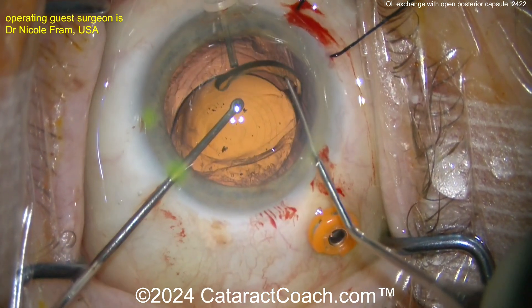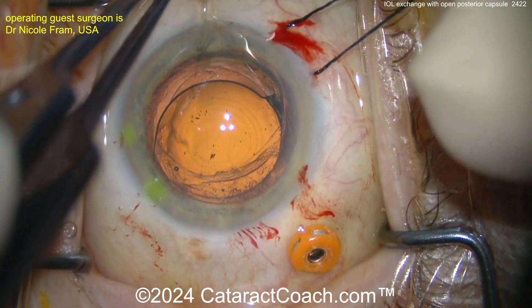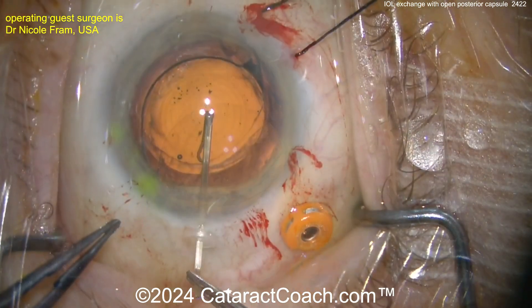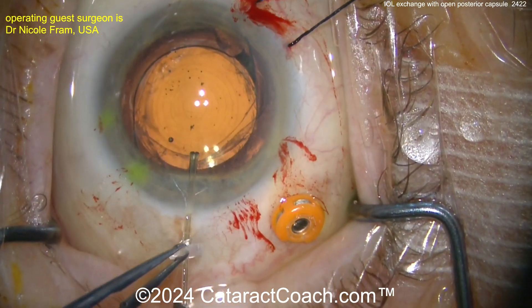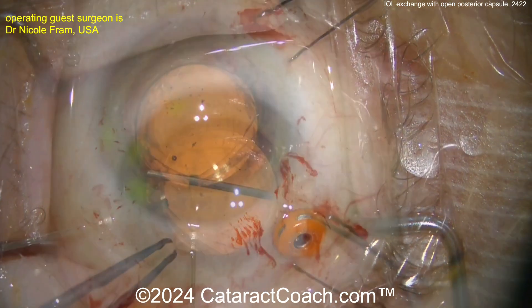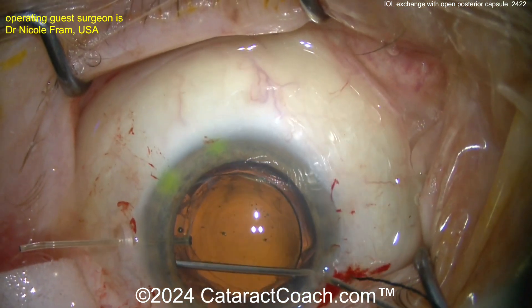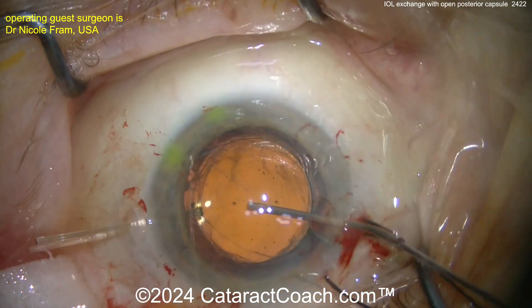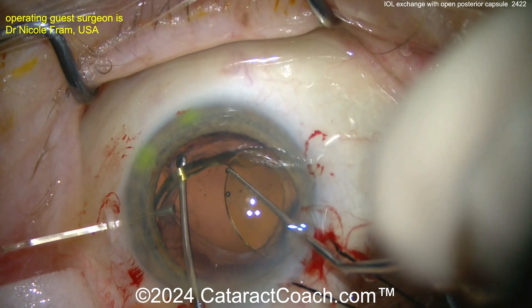I've done a lot of IOL exchanges and I actually don't ever use a traction suture, and I don't use a capsule hook here. But you know what, it's not a bad idea to be honest. With a capsule look, I don't think I'll do the traction suture, but still — the capsule hook placed on the other side is a good way of giving you counter traction. It protects and holds the capsular bag in place as you dissect out the IOL.